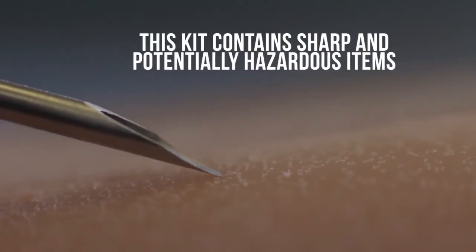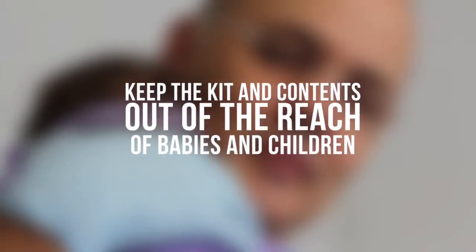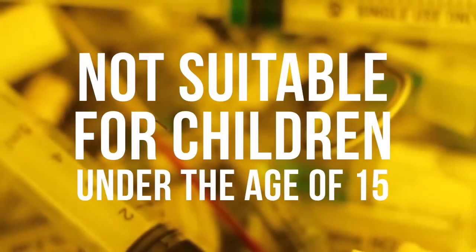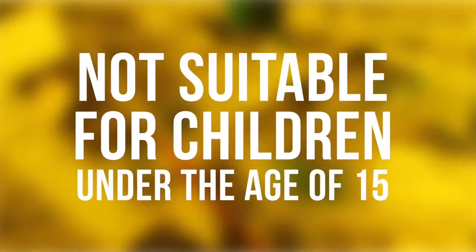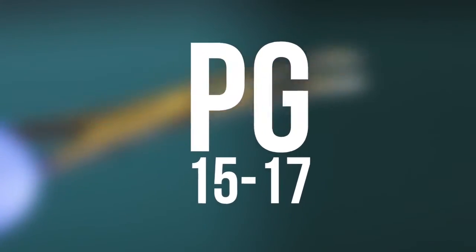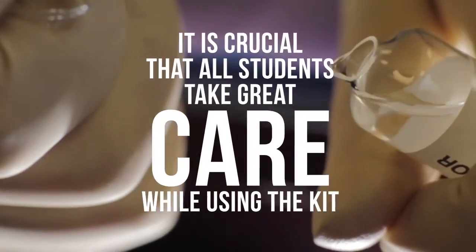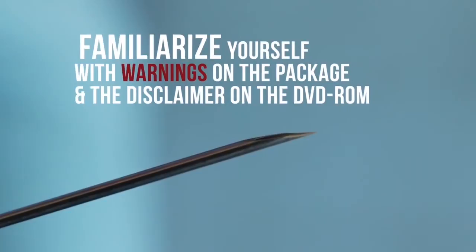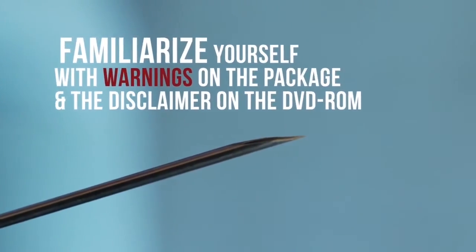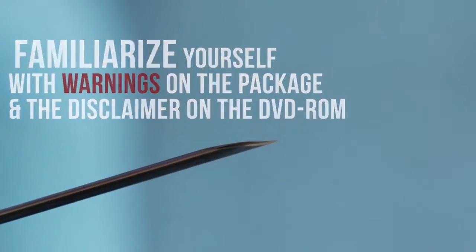Warning: this kit contains sharp and potentially hazardous items. Keep the kit and contents out of the reach of babies and children. It is not suitable for children under the age of 15. Adult supervision is essential for students under the age of 18 years. It is crucial that all students take great care while using the kit. Students, as well as their parents, should familiarize themselves with warnings on the package and the disclaimer on the DVD-ROM.